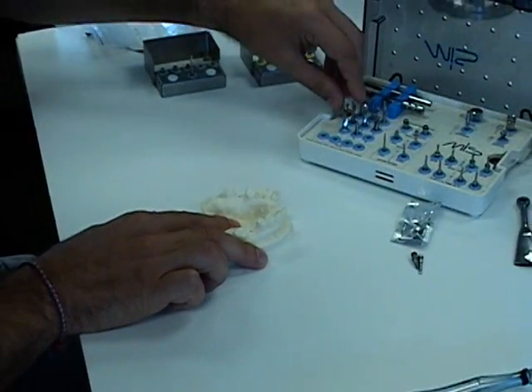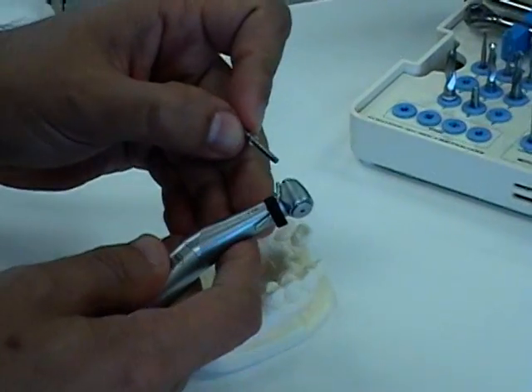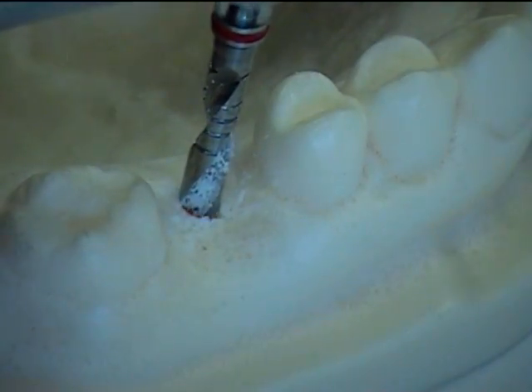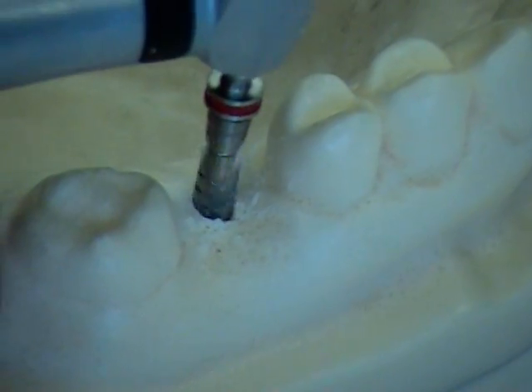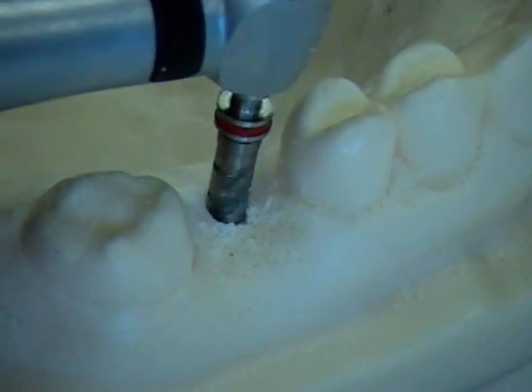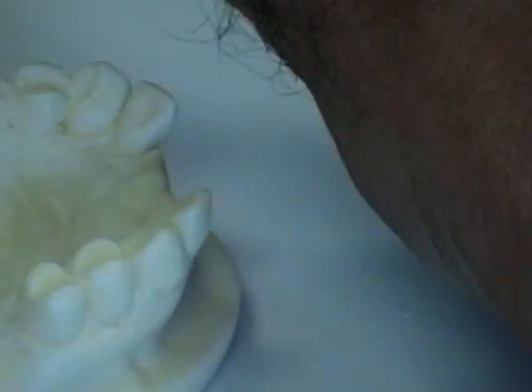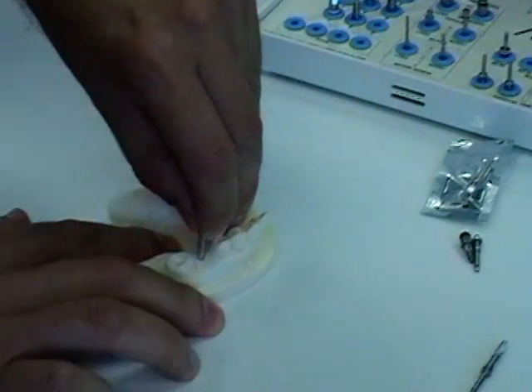Next step is to use the 3.2mm twist drill, which is color-coded red. Since this time we're drilling without the drill stop, we want to verify that we've reached the correct depth. You can do this by checking the lines on the drill to make sure it's at 13 millimeters, and then checking again with the body try-in for 3.2 millimeters. We will insert the 3.2mm body try-in to make sure the osteotomy is still at 13 millimeters total depth.